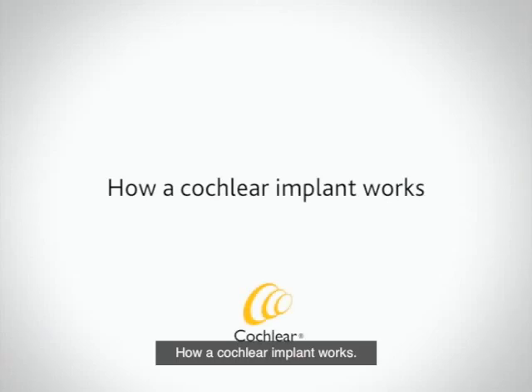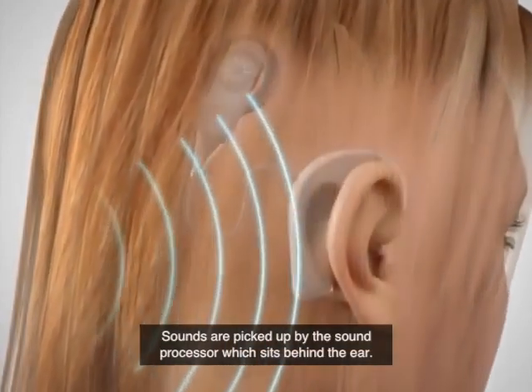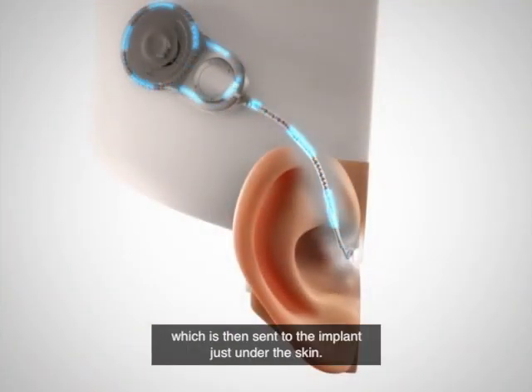How a cochlear implant works. Sounds are picked up by the sound processor, which sits behind the ear. These sounds are turned into digital code, which is then sent to the implant just under the skin.